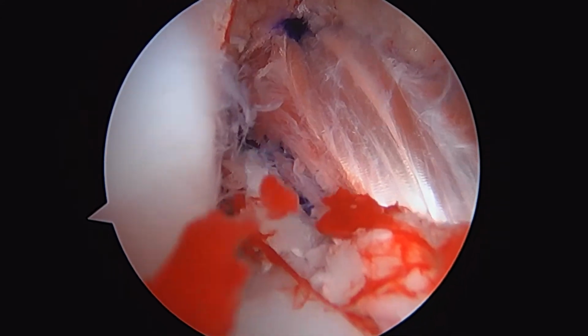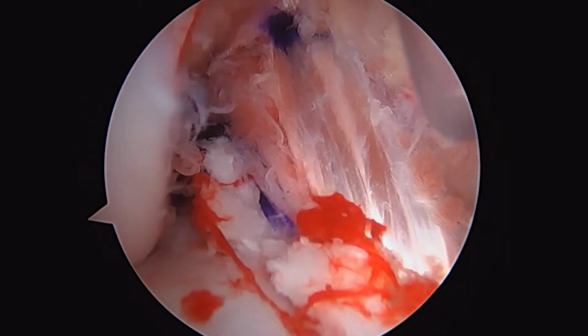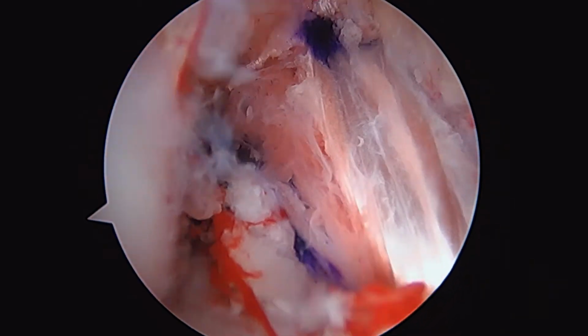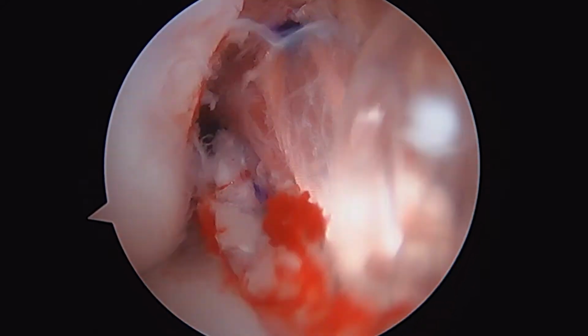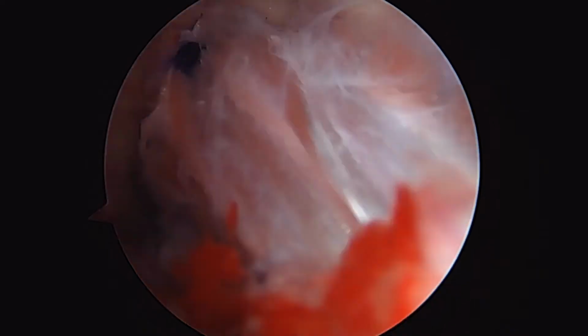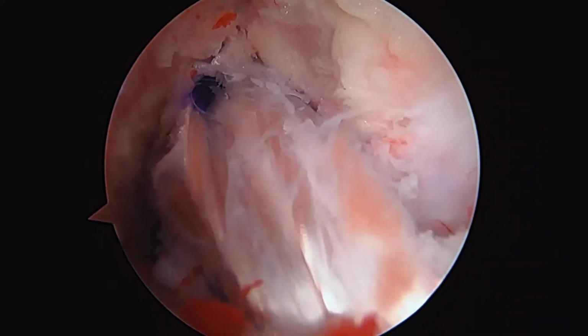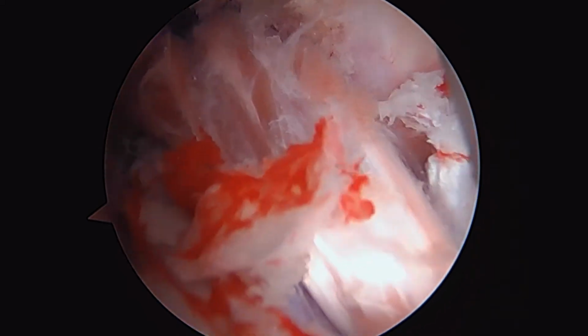Table all the way up. Okay, so this is what it looks like now. We haven't fixed it on the tibial side. It's fixed on the femoral side. I'm happy with the way that looks there. Hold the camera here just like that. We're going to go ahead and cycle the knee a little bit just to make sure there's good tension in the graft. Coker, I'm sorry. Never mind, I'll use this.